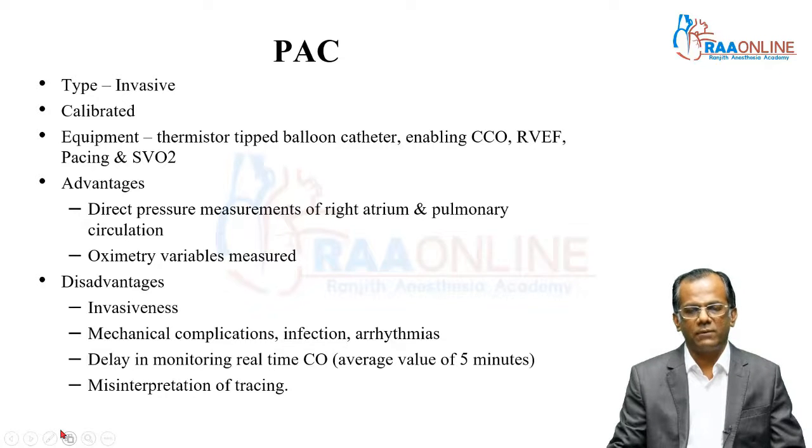What are the disadvantages of the PAC? It is invasive. You can have mechanical complications during insertion, infection, and arrhythmias. And even the continuous cardiac output monitor of PAC will average the cardiac output over a range of 5 minutes. So it's not really a real-time cardiac output monitor. And there can always be a misinterpretation of the tracing.